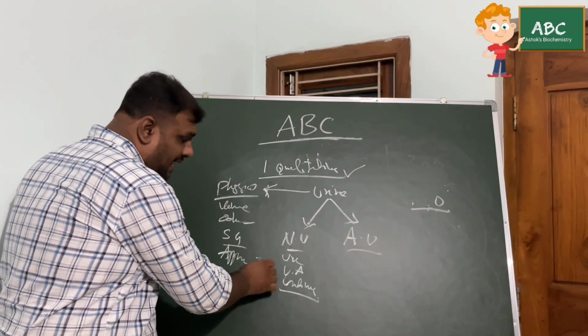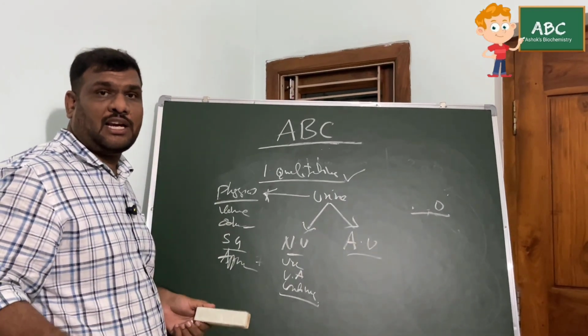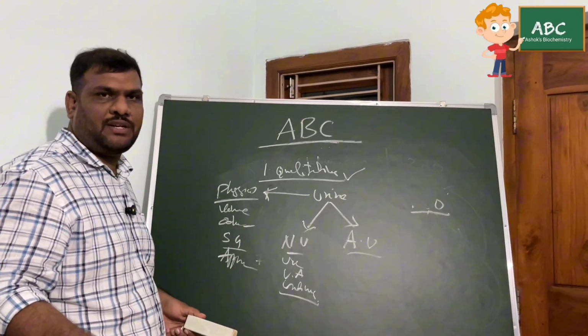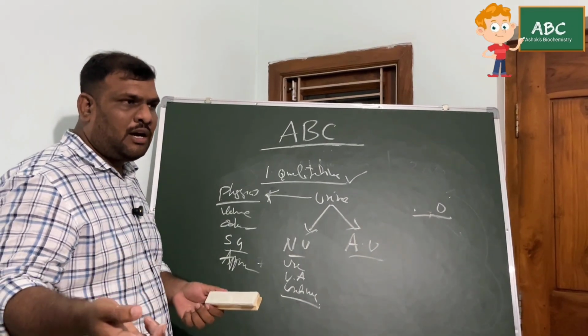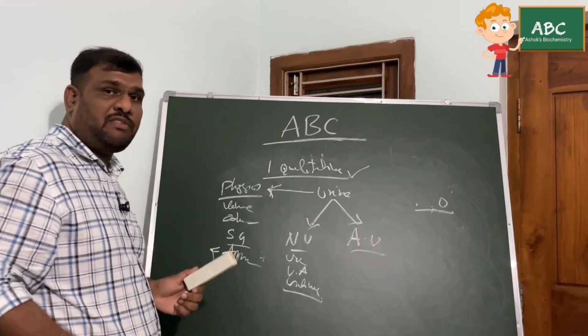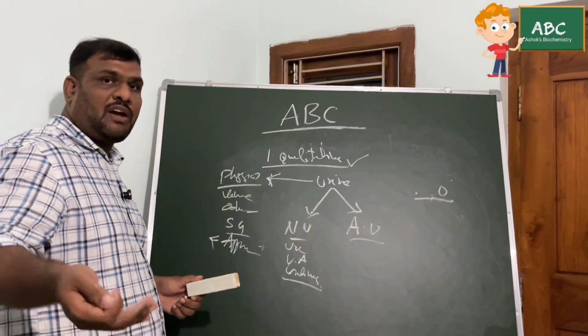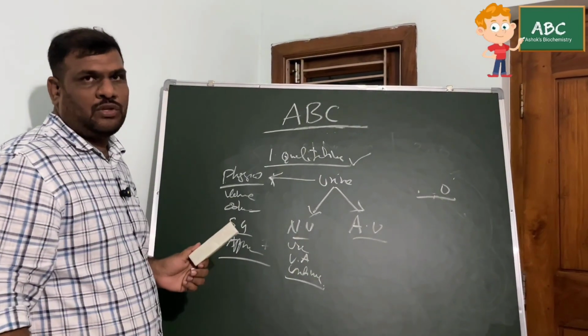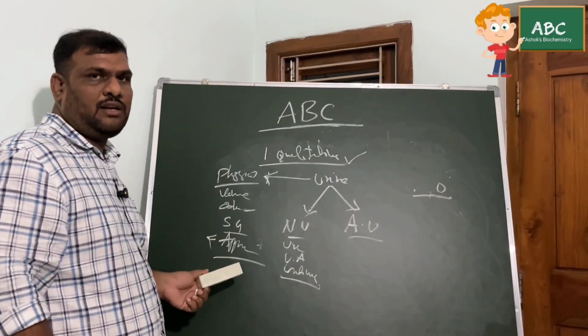Is it very transparent, clear? In a few conditions like alkaptonuria, phenylketonuria, MSUD, your urine color will be something different. In a few cases like blood in urine and all these things. When you see the appearance, the turbidity, if you're having proteins, there will be a turbidity. If you're having phosphate ions, there will be a turbidity. So appearance also matters here. All these things come under the physical examination.